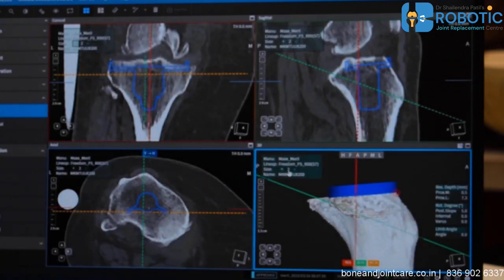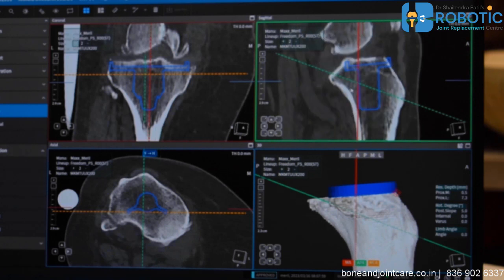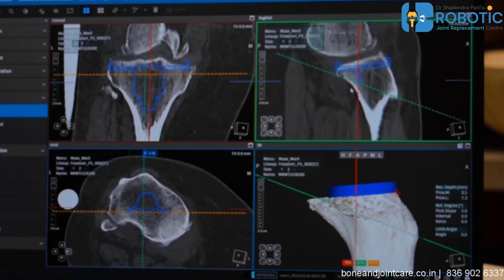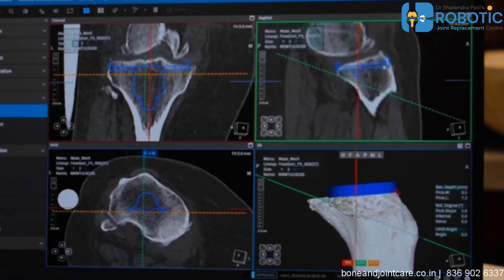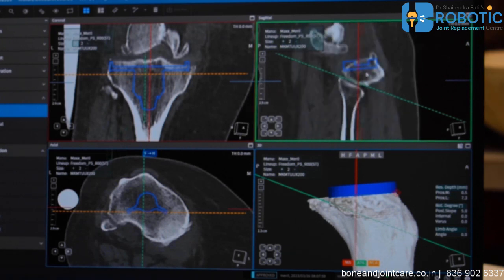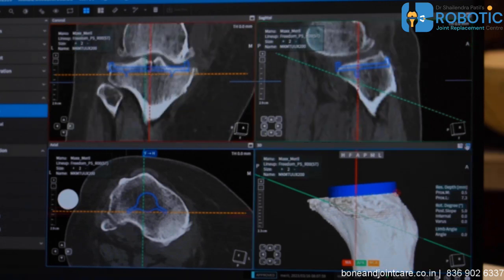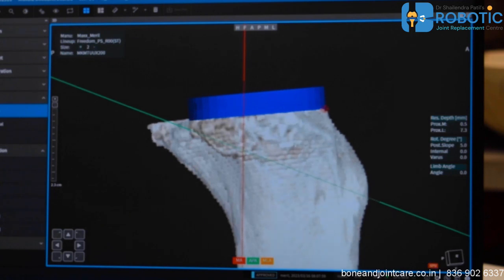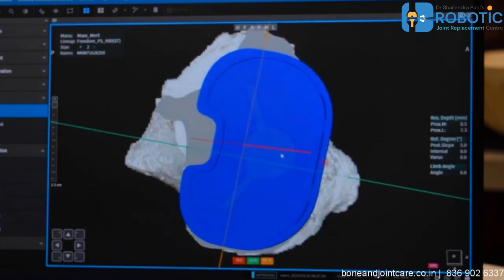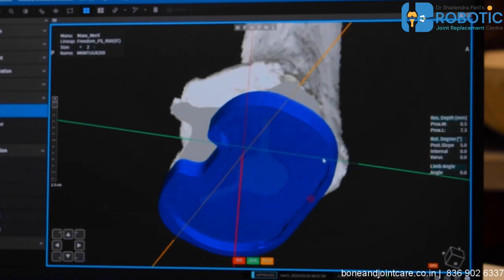The system shows, for example, a size 2 TBL base plate will be used. I can view this across all windows to see how it fits, match the slope and size as per the tibial bone CT cuts. I can enlarge any window and see how the implant fits from all directions, which is not possible with first or second generation robotic systems.